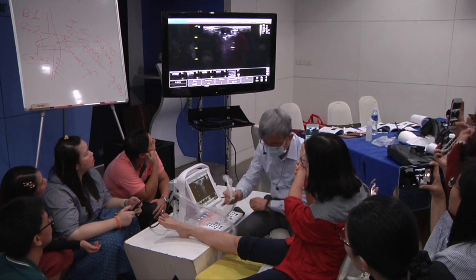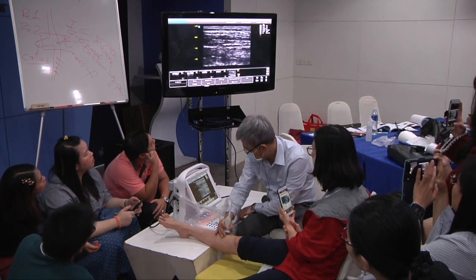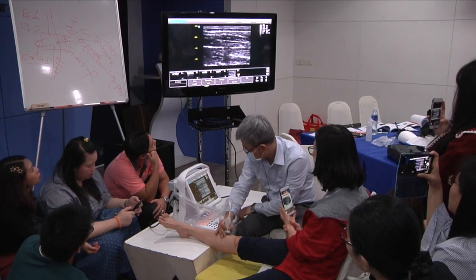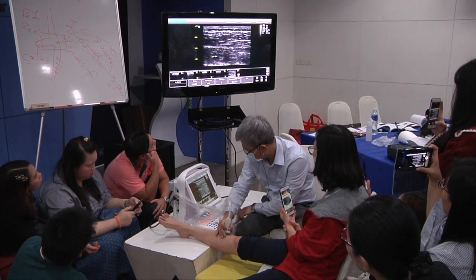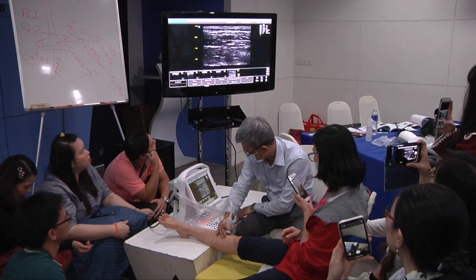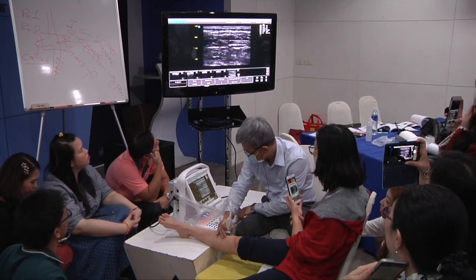So the distal side is okay. The proximal side is not clear, so I have to move. The central aponeurosis in the proximal side is not clear.